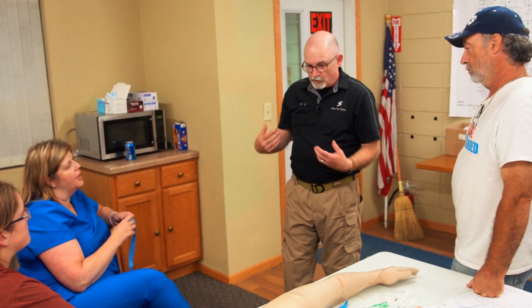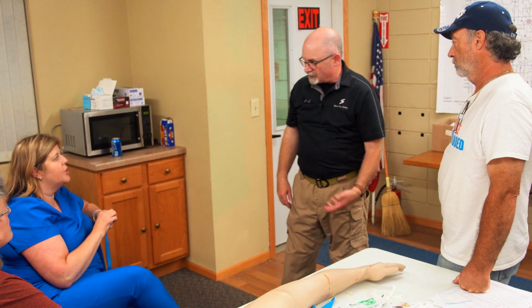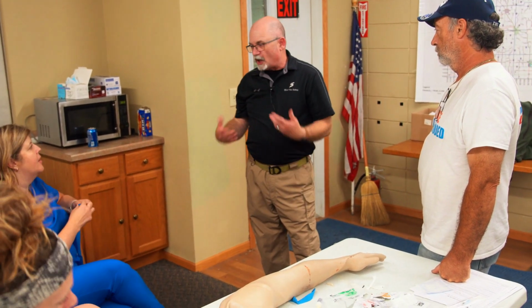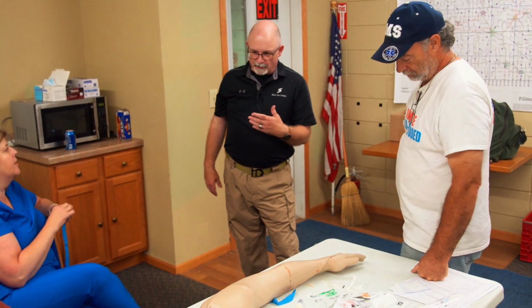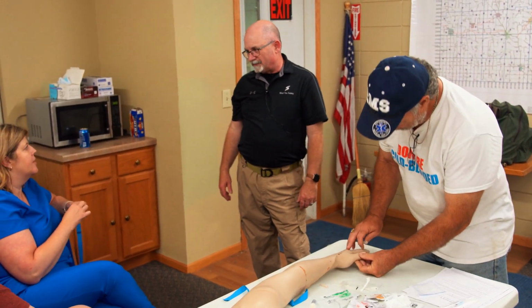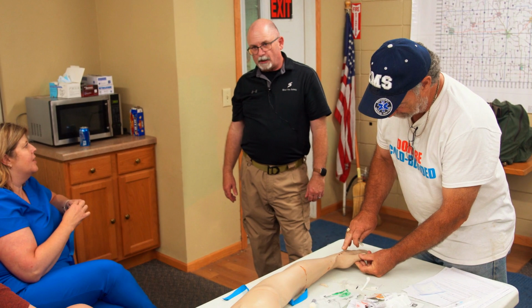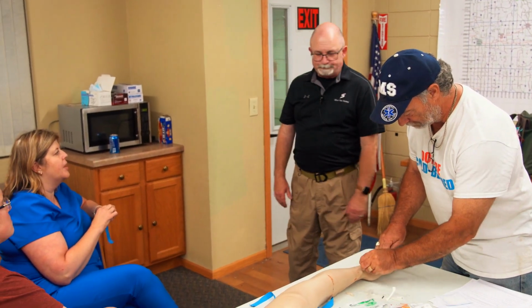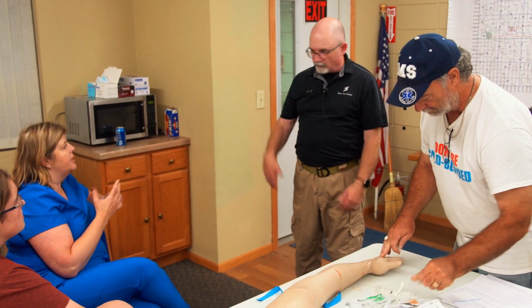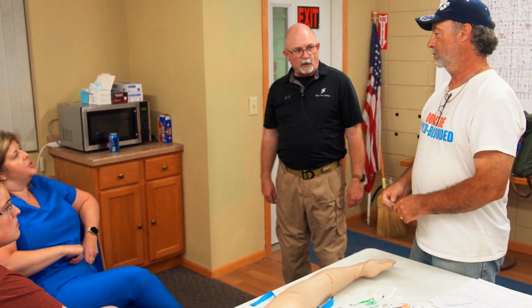You have somebody that's got a horrible arm fracture or whatever, same rules. We would need to get access, we would use it if we get access. Okay. So there again, you get the little old lady with the hip pain. Don't you dare cut my clothes. Okay, well, we'll do our best, but if you need to cut away, right.